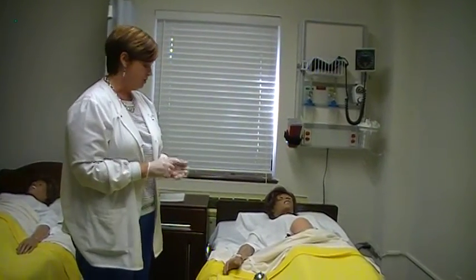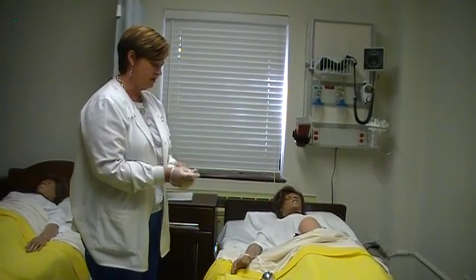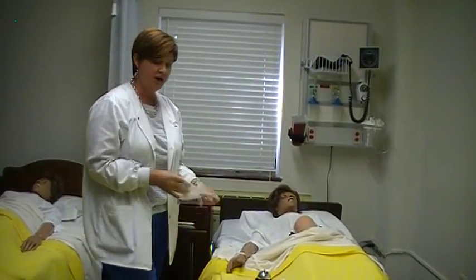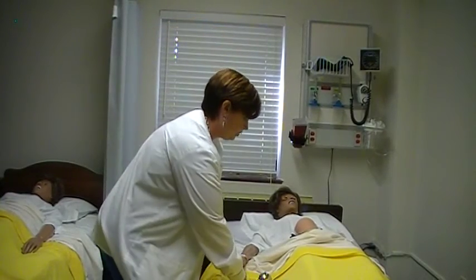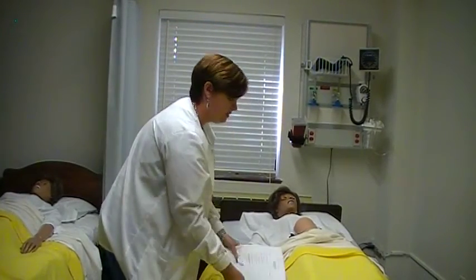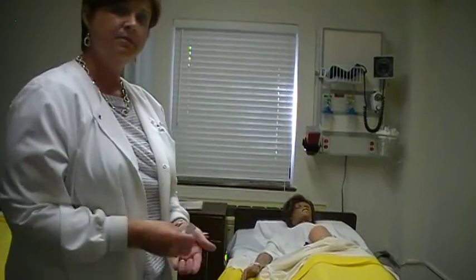Next, we're going to take off our gloves, wash our hands, and document the procedure. Since this is a routine medication, the only place we need to document is in the MAR.